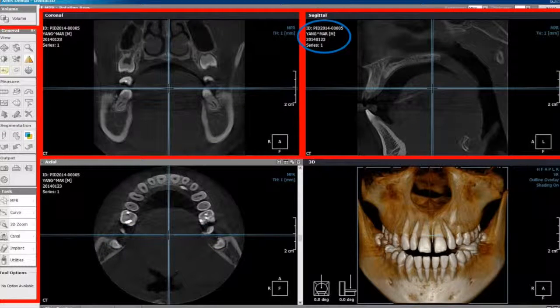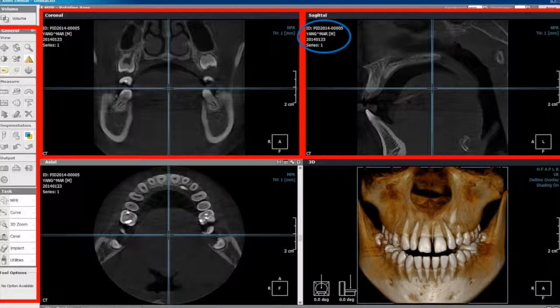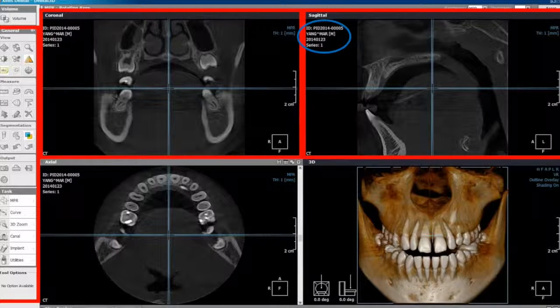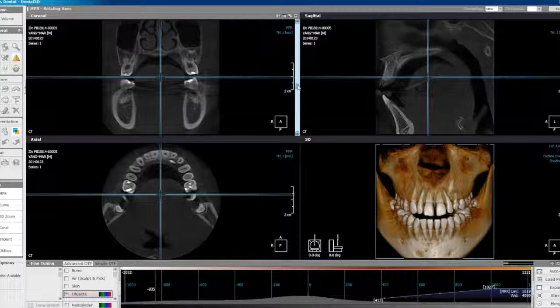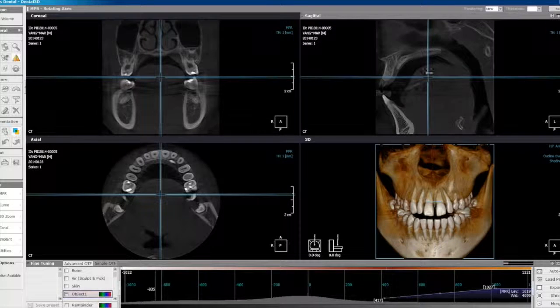Right of that is the sagittal plane. This plane displays a cut through the anatomy from medial to lateral, separating the left from the right. The sagittal plane view can be adjusted as previous.